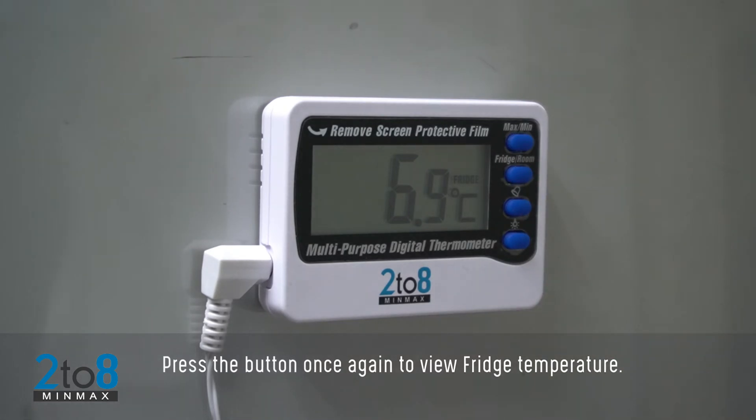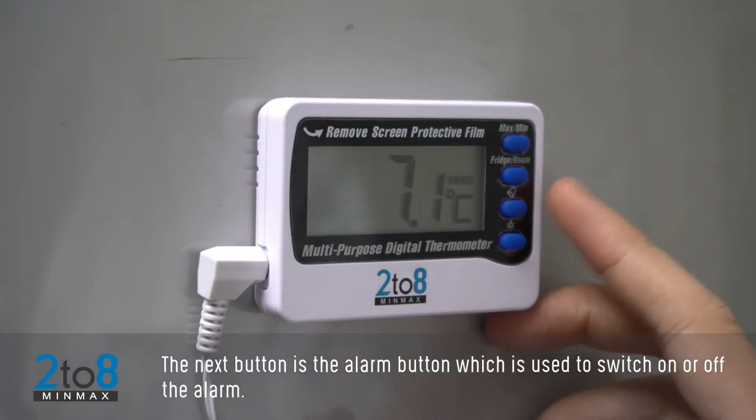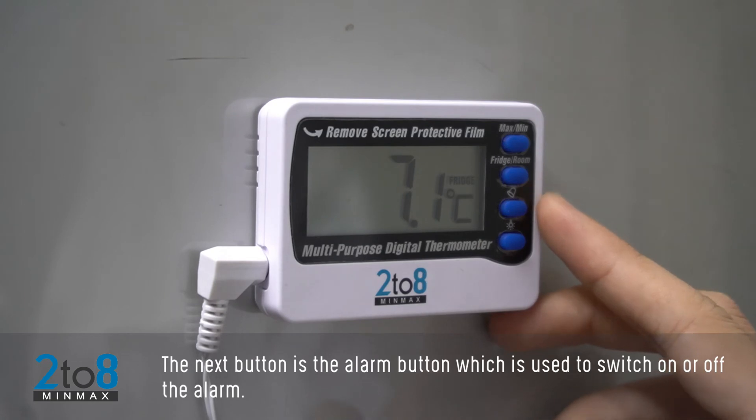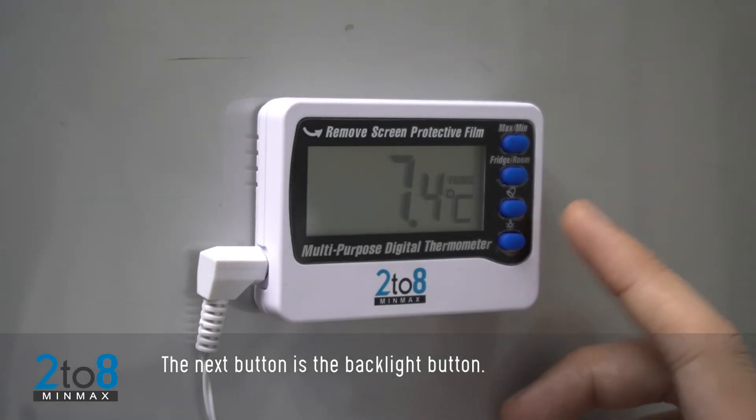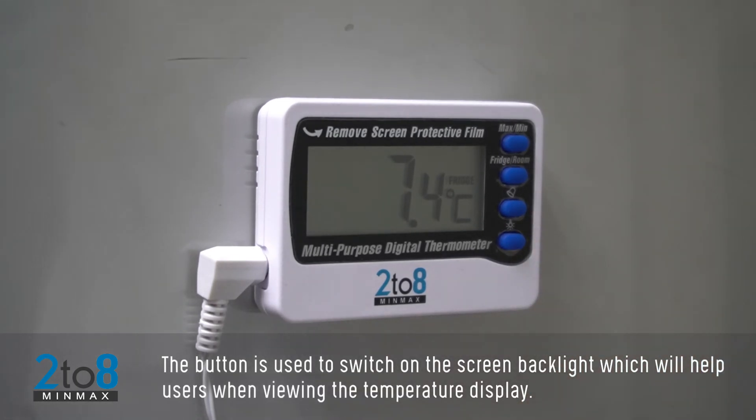The next button is the Alarm button, which is used to switch the alarm on or off. To learn more, watch the next topic on how to set the low and high limit alarm. The next button is the Backlight button, used to switch on the screen backlight to help users view the temperature display in low light.